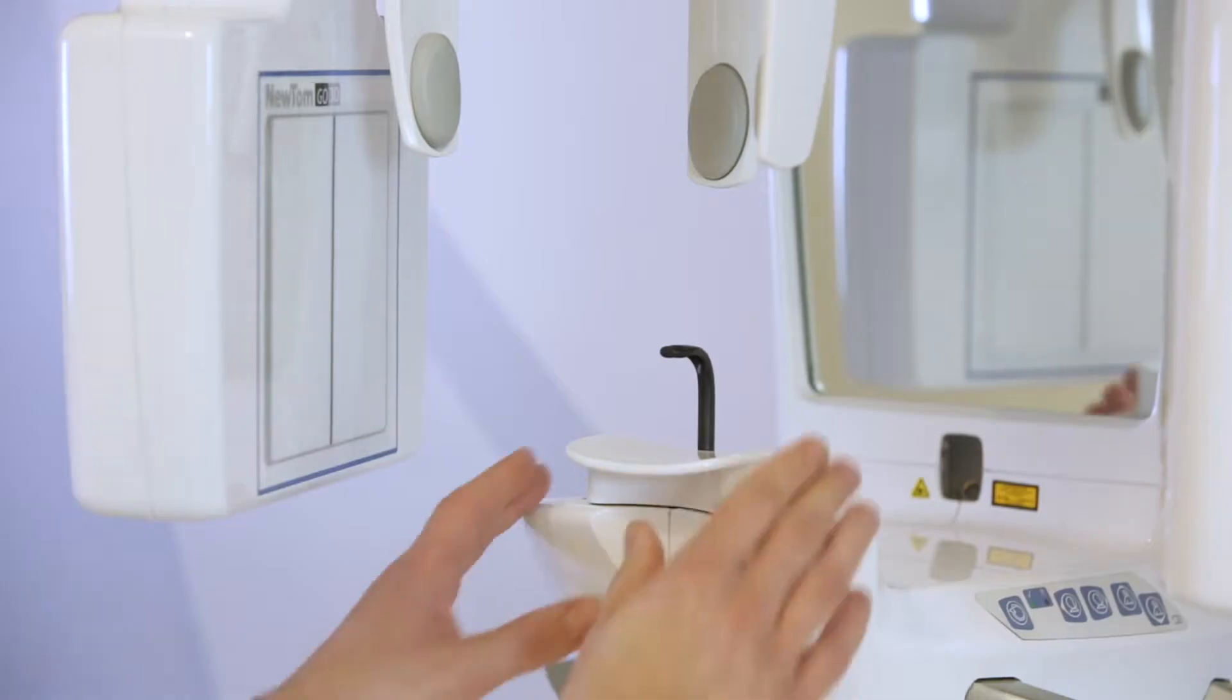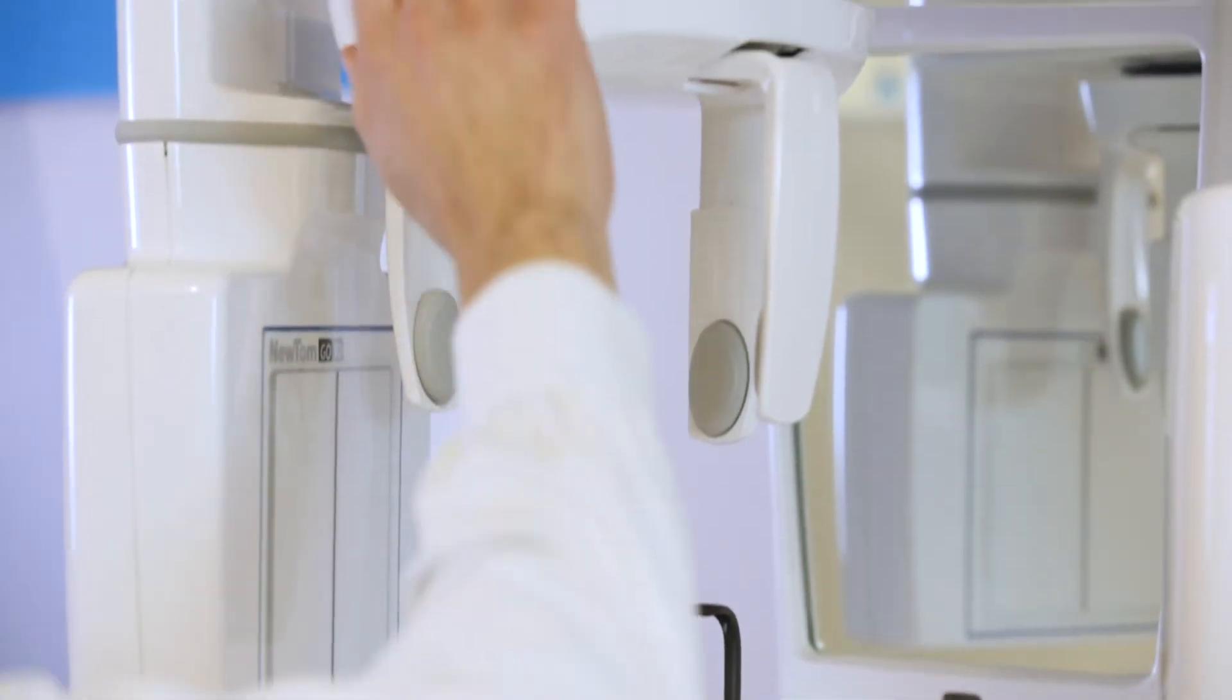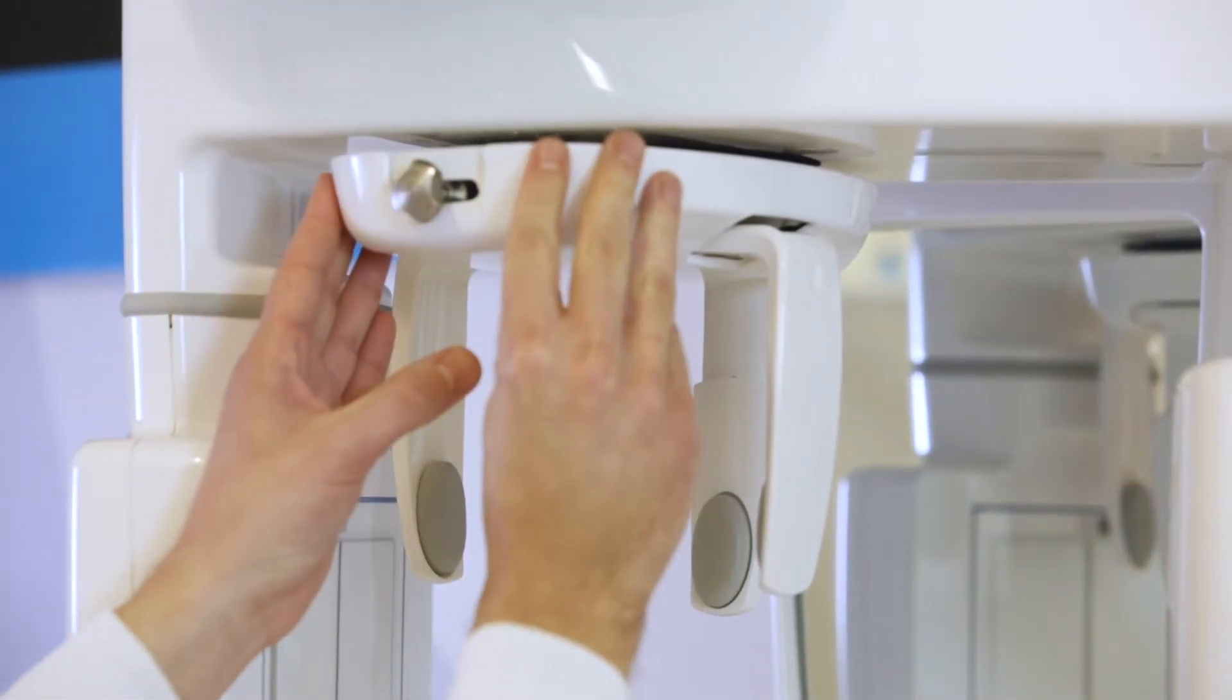Once the default position has been reached, the dentist must place the support element before positioning the patient.